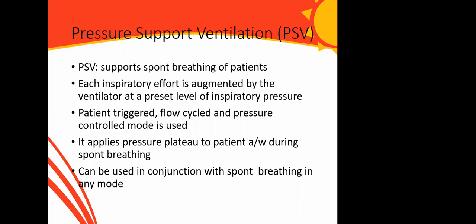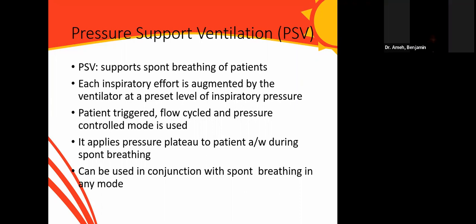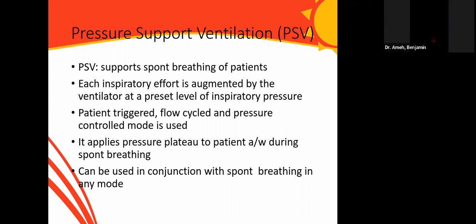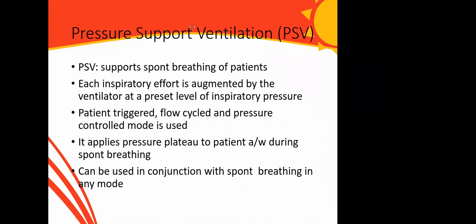What happens is that you apply pressure to help the patient overcome resistance or dead space from your tubings, your tracheal tubes, even from the apparatus dead space from the mechanical ventilatory device. So it helps to overcome that so that the patient doesn't have to develop pressure to overcome some of this resistance.